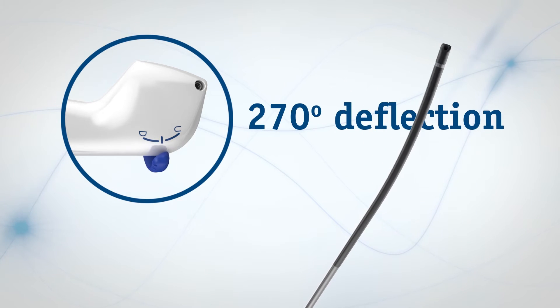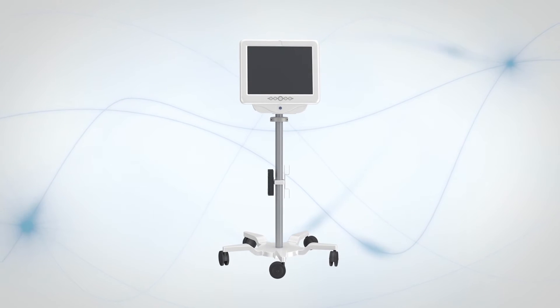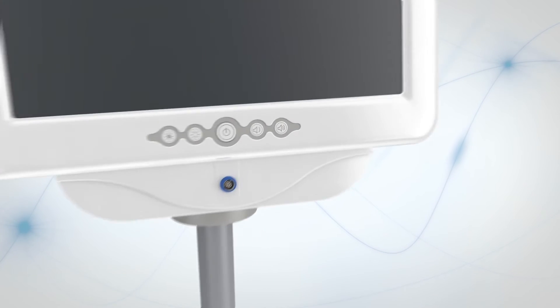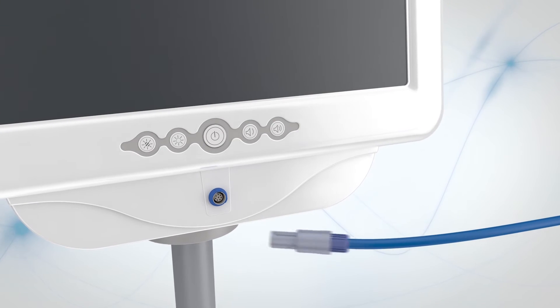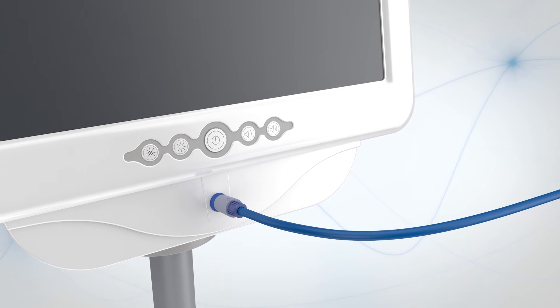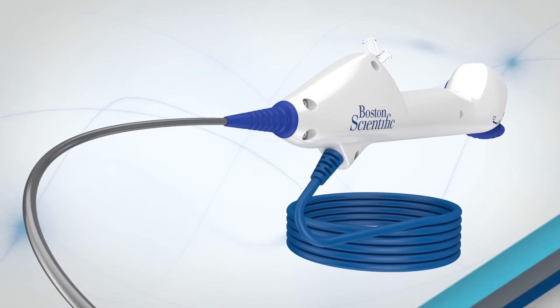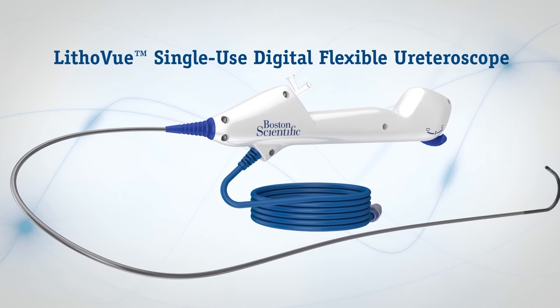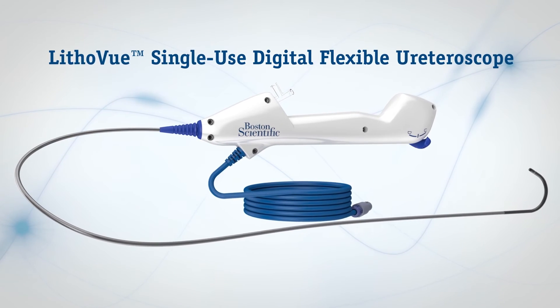The system allows you to navigate towards the targeted treatment area, even in difficult anatomy. This all-in-one solution must be used with the LithoView workstation with monitor and integrated image processing software, or connect via the workstation to your existing OR monitors and recording systems. The LithoView single-use digital flexible ureteroscope — manage your cases as you always have, but with no repairs, no sterilization, no compromise.